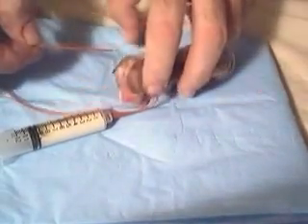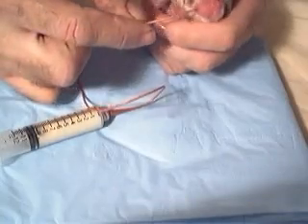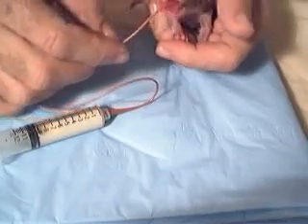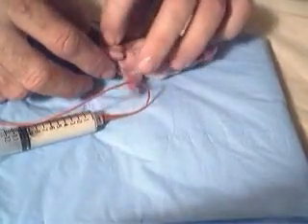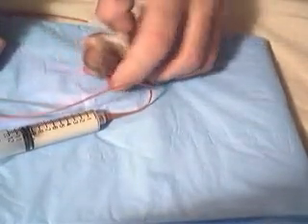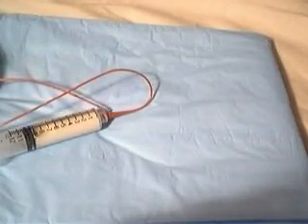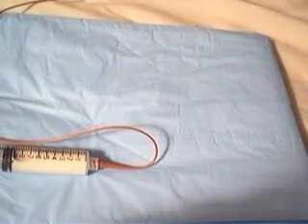And when I insert it, it's important that you have the neck bent. It's real hard to get it down the windpipe if they're moving their tongue and if they're swallowing. But if you keep the neck extended like this, hard to see because he's so little, they would usually cough, and they would probably object greatly to what we were doing. But the trick is, if you can get them swallowing with a bent neck, then we'll go ahead and do another one, so we might as well make sure we get what we need for this video.